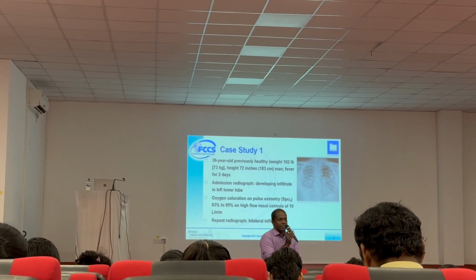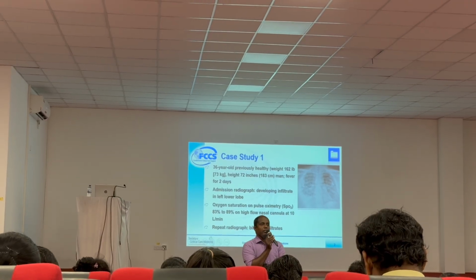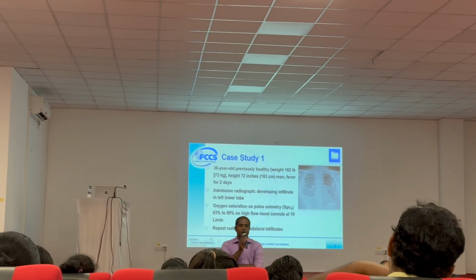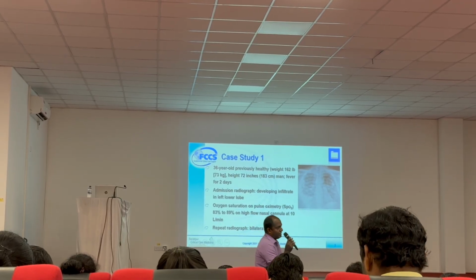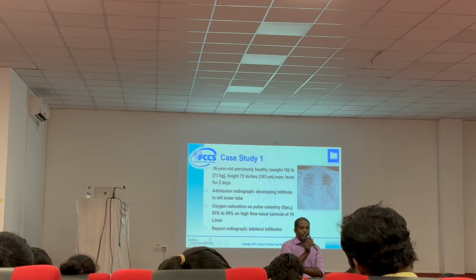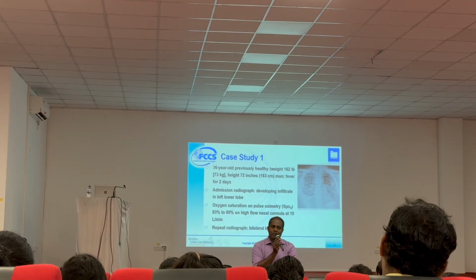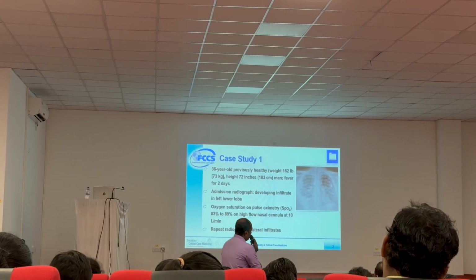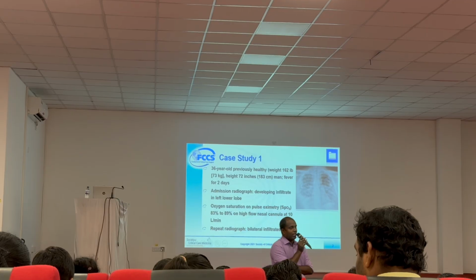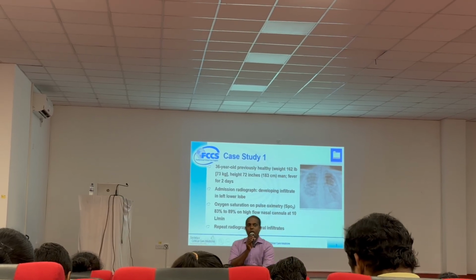So the prescription is low tidal volume based on the ideal body weight. Why ideal body weight? Let me give a case scenario. We got an obese man, a 100 kilogram gentleman, who came to the ICU. His height is around 155. Another gentleman is also 100 kilogram, but his height is 175. So do you ventilate the same tidal volume for both?